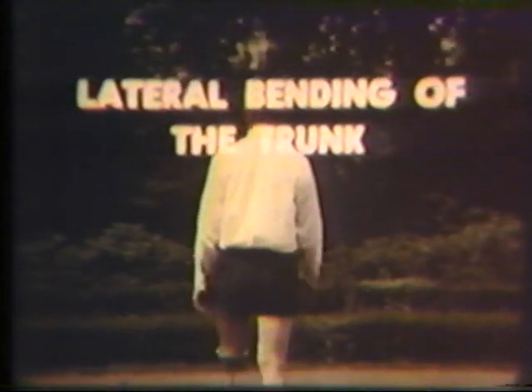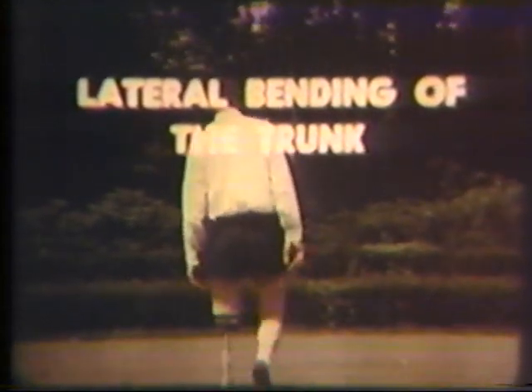The first gait deviation you are viewing is lateral bending of the trunk. This defect is characterized by excessive bending of the trunk laterally from the midline. In almost all cases, the bend is to the side of the prosthesis. Usually the average lower extremity amputee will demonstrate this to a very slight degree; however, what you see now is considered of sufficient magnitude to be abnormal and therefore a true gait defect.